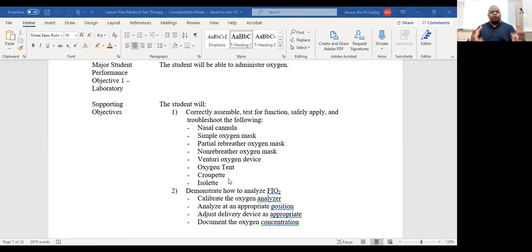All of these things are your domain. When you go to the hospital, you're in the NICU and the baby is in a little incubator, that is your domain. That is respiratory. That is your responsibility to make sure the heat is right, the oxygen flow is right, the amount of oxygen is right, the noise is not too much. That is your baby. The croup tent, when a little baby has croup, there's a tent that you can set up around the bed for a croupette. And so all of these things are in your toolbox.